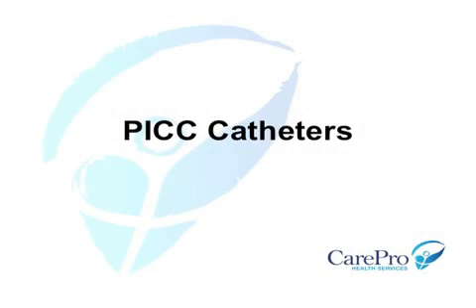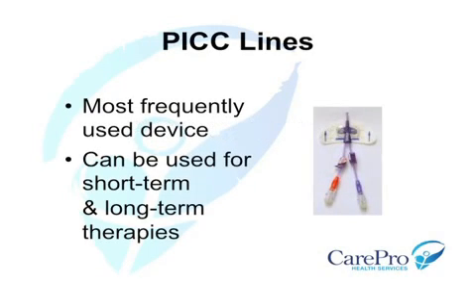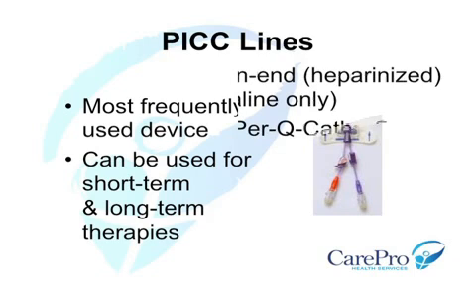PICC catheters. PICC line catheter usage has greatly increased over the past 10 to 15 years and is currently the most frequently used device in the home care setting. The catheter, which is usually inserted in the cephalic or basilic vein of the upper arm, may remain in place for several weeks to several months, barring any complications. It is suitable for both short and long-term therapies.